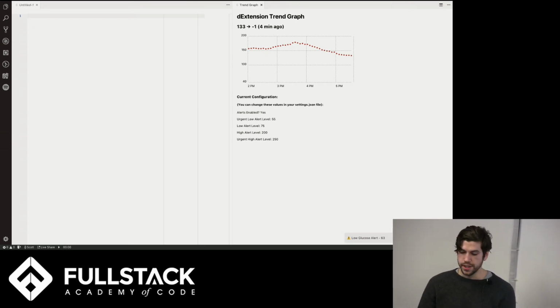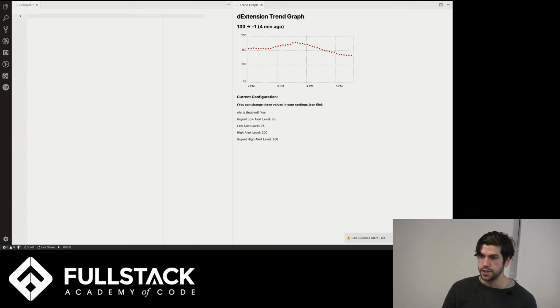Yeah, that's pretty much it. It keeps you informed and aware of your blood sugar without disrupting your workflow.